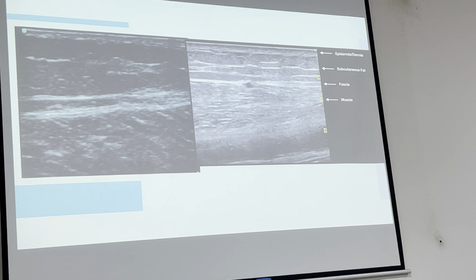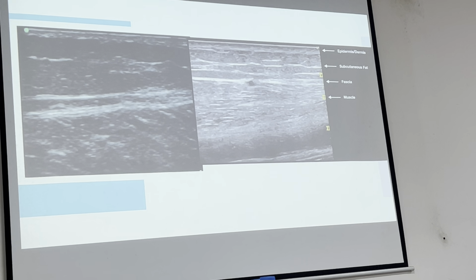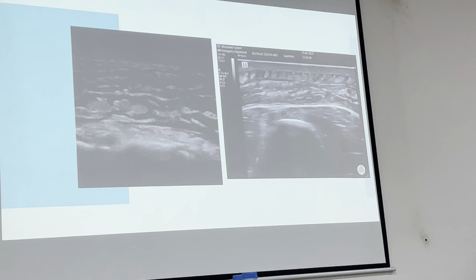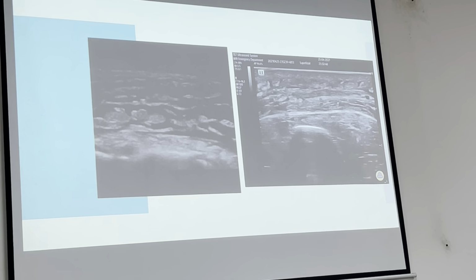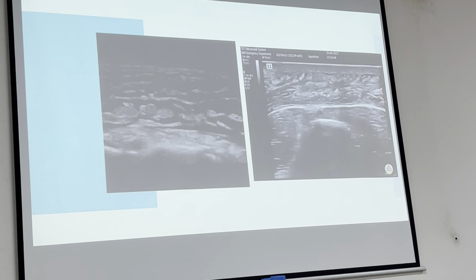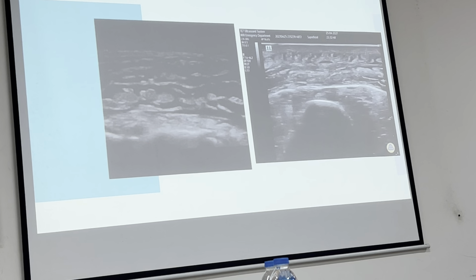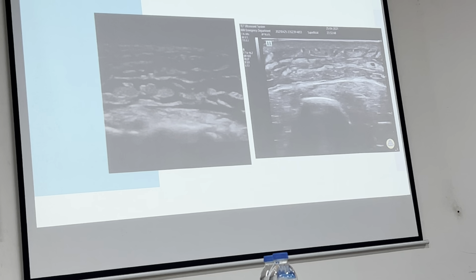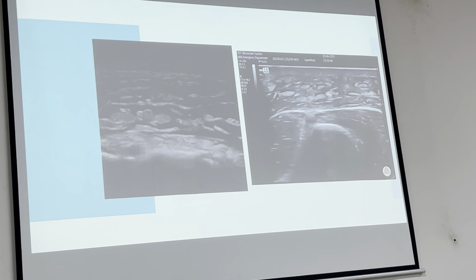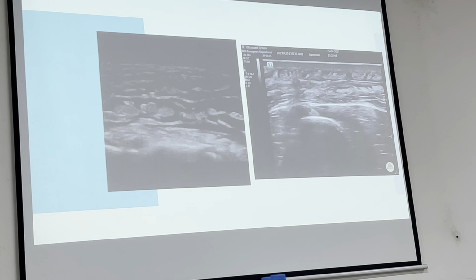And now what we want to know is what happens when some of this organization breaks down when there is an infection nearby. So, does anybody know what this finding is called on here? Or what might be happening for this ultrasound? So this right here is cellulitis, and as we said earlier, you want to know what the clinical picture is of this patient.